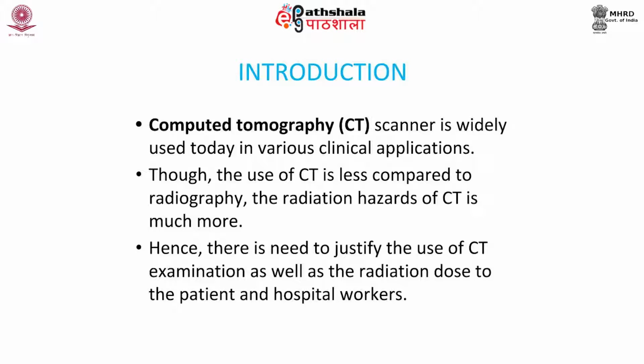Though the use of CT is less compared to radiography, the radiation hazard of CT is much more. It is stated that it produces around 50% of the radiation dose to the patient population compared to radiography, though the use of CT scan is only 8%.